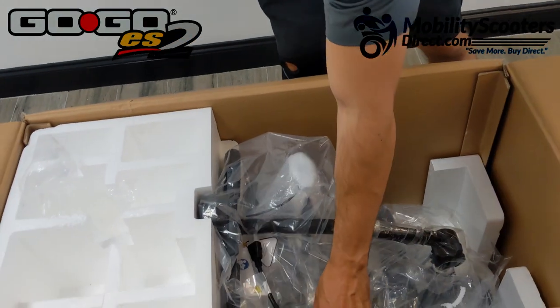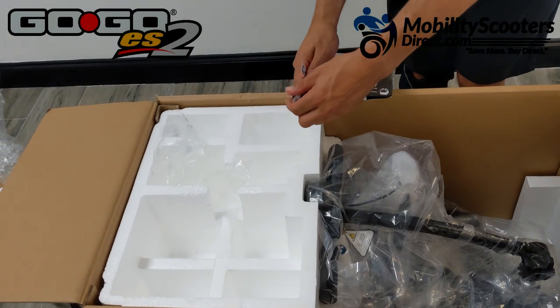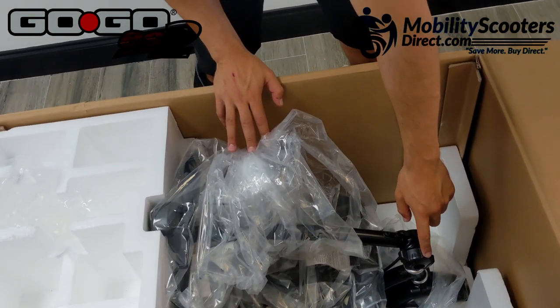The next thing you're going to want to do is reach for the box that has the charger in it. You'll notice it has a little wall plug coming out of the box, which is used to plug right into the wall. We'll show you how to use that shortly.